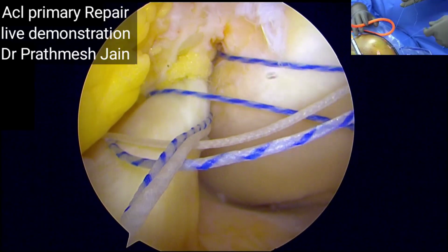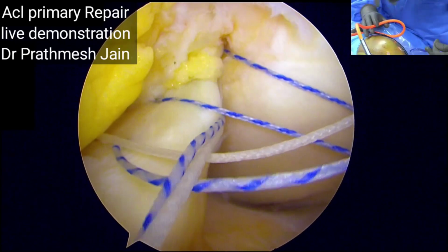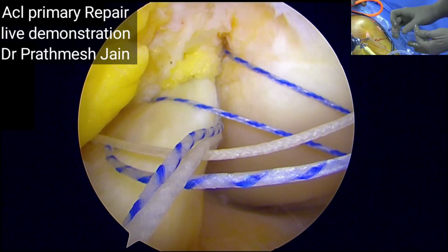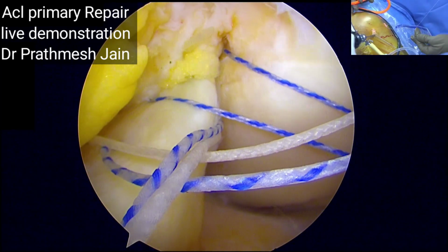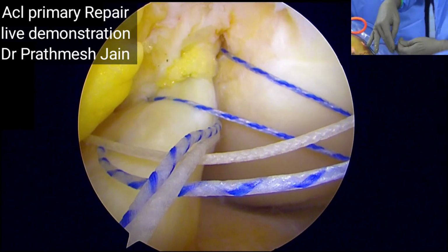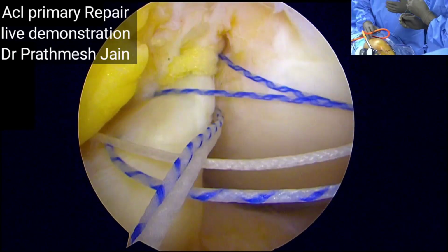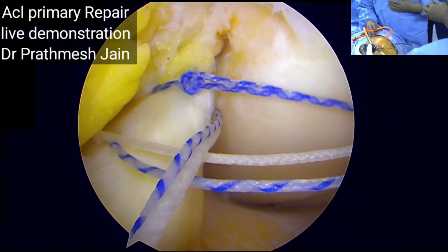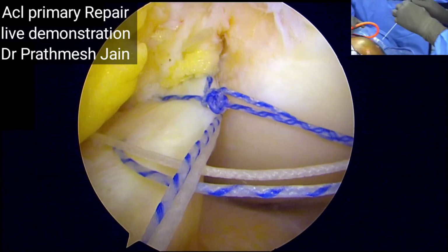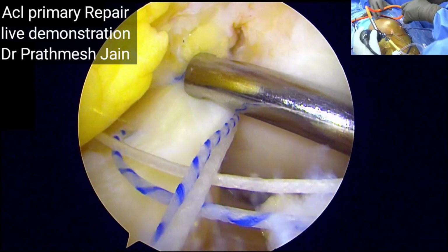So these are all the things that we have learned from our experience of the rotator cuff, and we'll be doing the same kind of repair. Earlier I used to do the knotless pattern of repair using a lateral row anchor, but I have given up that technique in favor of this technique because this is a more minimally invasive technique. The sutures that we are using here are very low profile. It's a modular technique. You can modify your tension. You can place your sutures more accurately. There are fewer chances of any cutout.